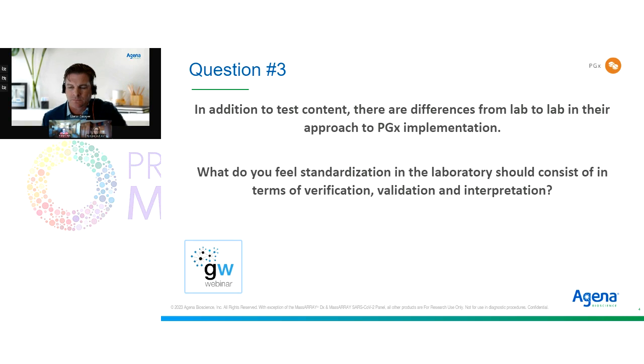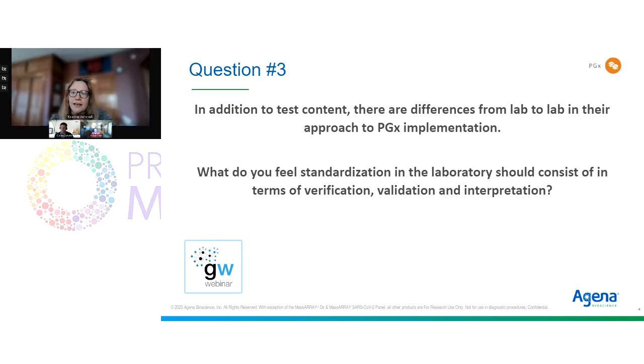Yeah, I think making sure that you're adhering to the guidelines. I would highly recommend that any laboratory be part of the CAP PGX proficiency program, so that you can make sure that you're aligning. And I think we should make AMP Tier 1 a minimum, because even if you're calling right for what you're doing at your laboratory, I don't think it should necessarily meet that bar if there isn't AMP Tier 1 coverage at a minimum.